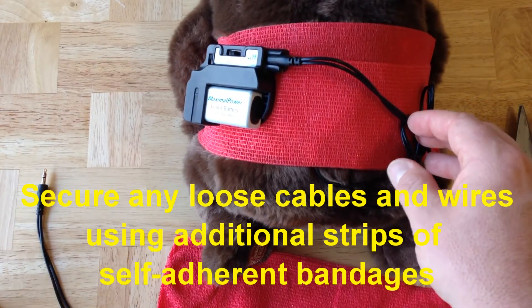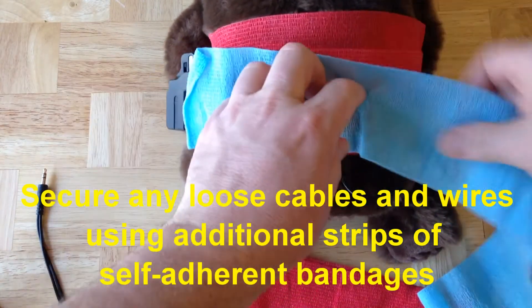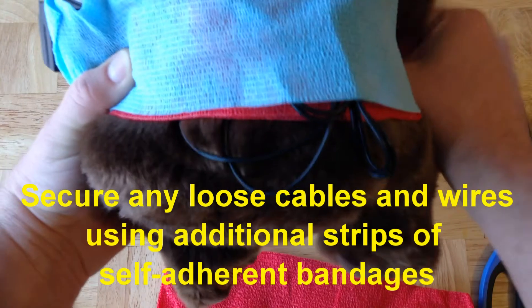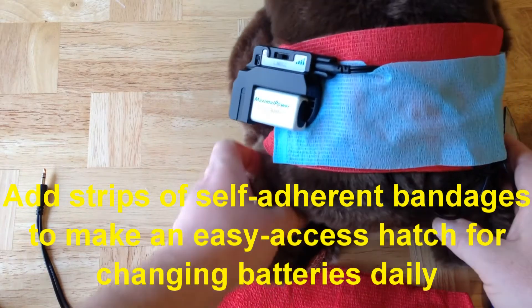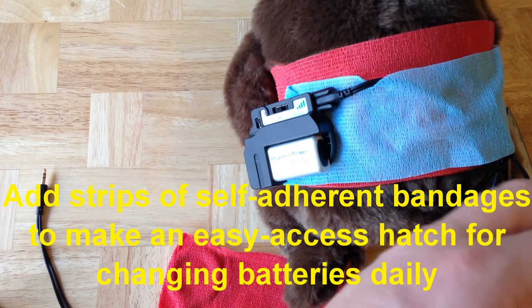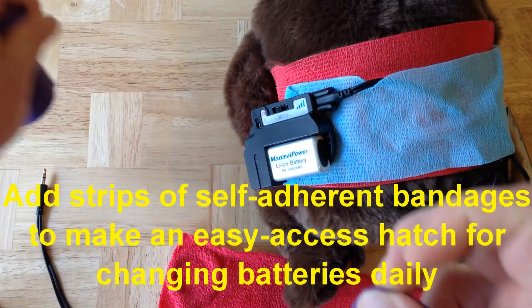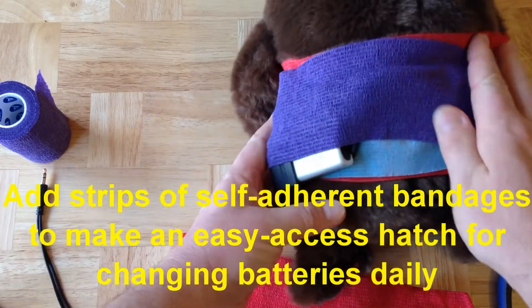As a general rule, you want to keep the wires quite secure since you don't tend to need to remove those very often, so you might wrap those several times with several strips of self-adhering wrap. In the case of the pulse generator, you want to be a bit more cautious. Usually you need to replace the battery once every day, so what you might want to do at the very end is create a sort of hatch door — something that would be very easy to remove and work on the pulse generator.